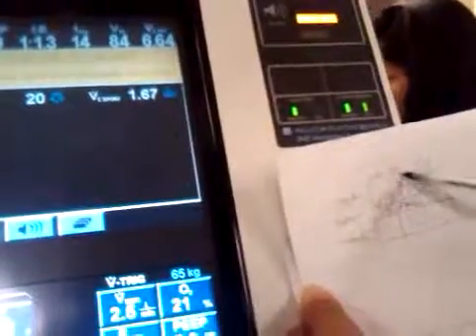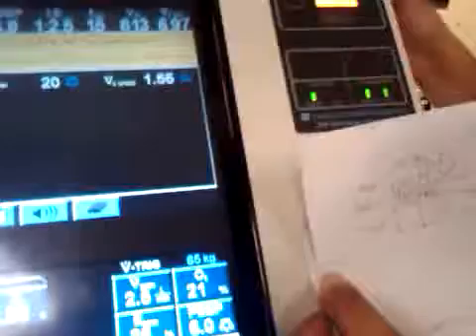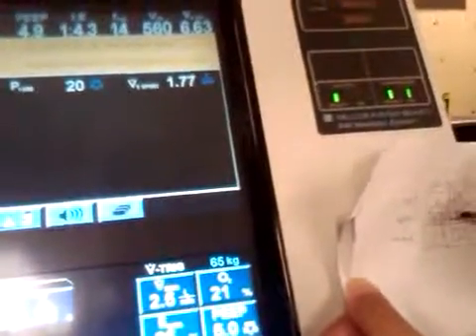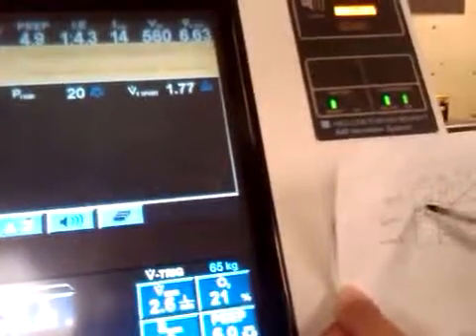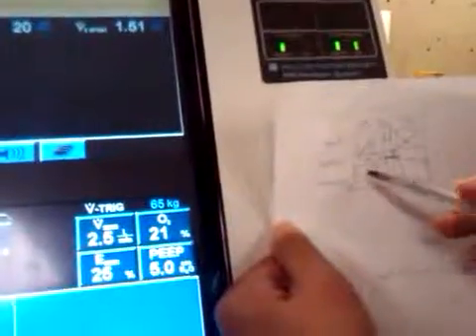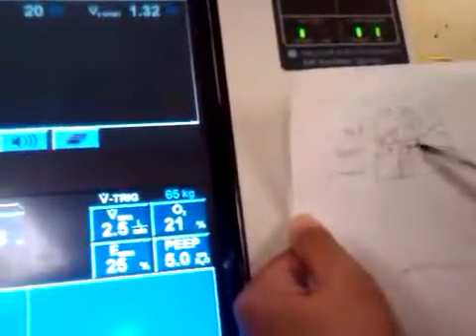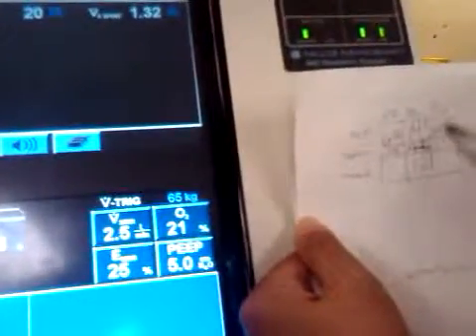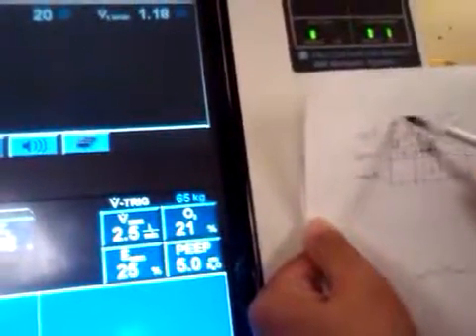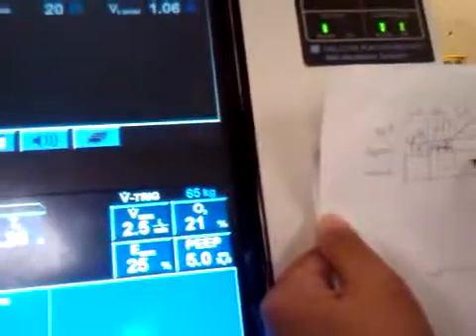And then respiratory rate, total respiratory rate 14 minus mechanical rate, which is spontaneous, that would be 2 right here. And then 6.01 minus 1.95, and you plug that in here, and then spontaneous minute volume divided by spontaneous respiratory rate, you get the tidal volume here. Minute ventilation mechanical divided by respiratory rate, you plug that into the tidal volume.